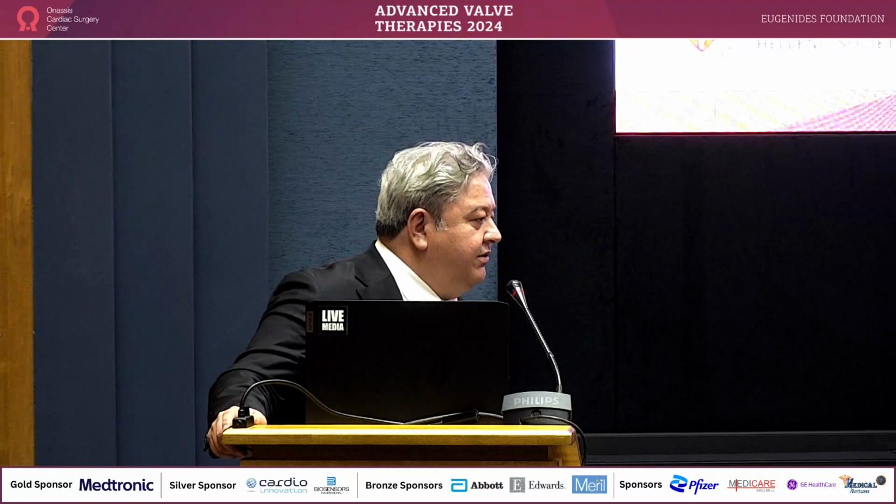severity of the paravalvular leak. You would agree also, to finish, that sometimes we close a patient who has cardiac failure, heart failure, and then if you leave a leak, you might develop hemolysis. So it might change the indication. That's the other thing that you have to consider.